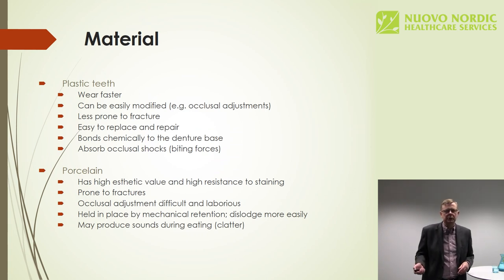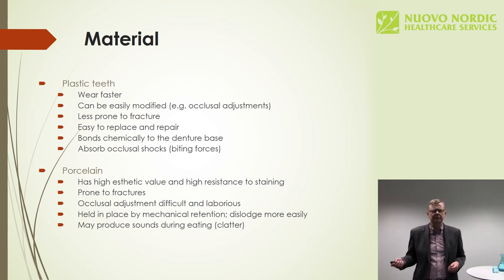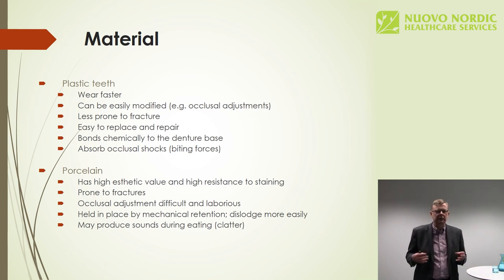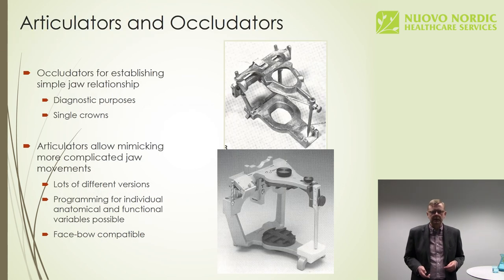We could use lots of different materials for the teeth. However, nowadays it's only plastic teeth. Porcelain teeth are more or less history. They may look a bit nicer, but it's awfully difficult to adjust the occlusion. They break more easily. Their retention in acrylic is not as good as that of the plastic teeth. So we will go into using plastic materials.